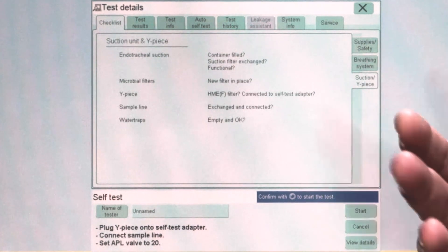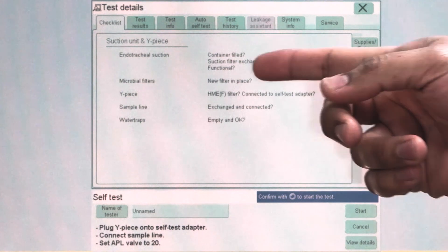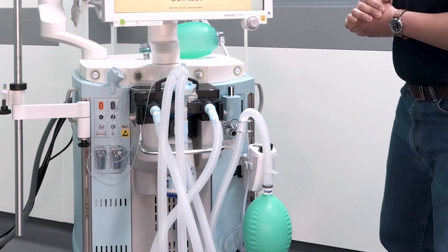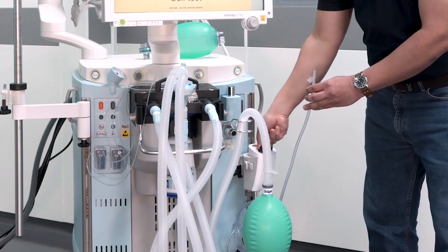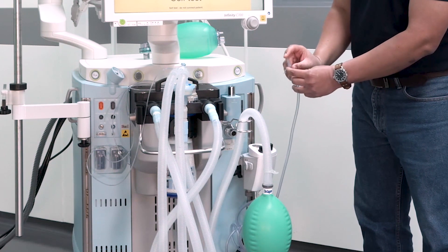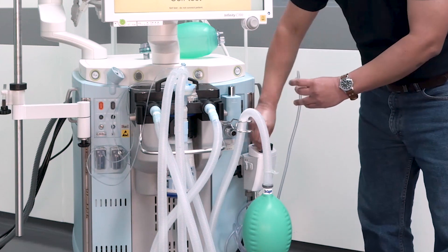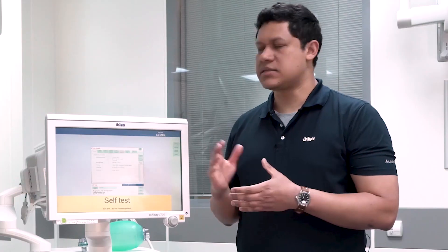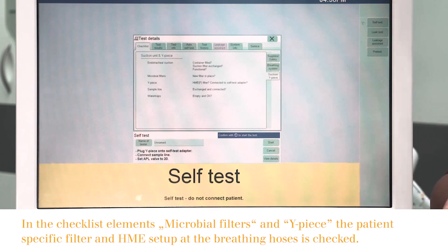The next group of components to verify are the ones related to the suction unit and the Y-piece. First, you have to check on the endotracheal suction. You have to make sure that the container is not filled, that the suctioning filter has been exchanged, and that the unit is functional. To do so, you take the hose and take it to the maximum level. Then you occlude the tip and make sure that you have flow and suctioning on the tip. The next element to verify, in case you have it, is the microbial filters — make sure that a new filter is in place.